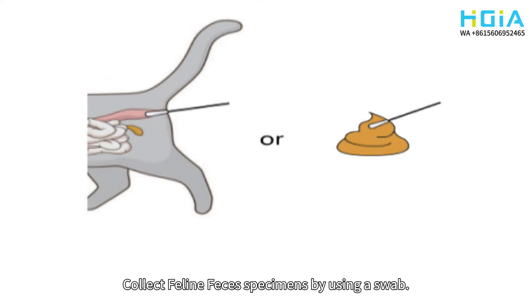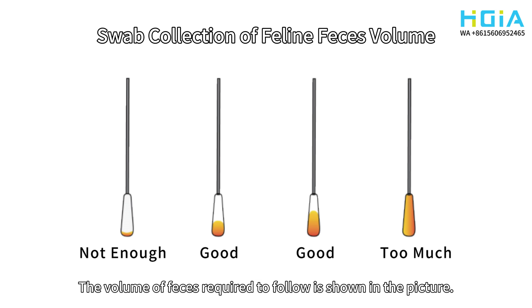Collect feline feces specimens by using a swab. The volume of feces required is shown in the picture.